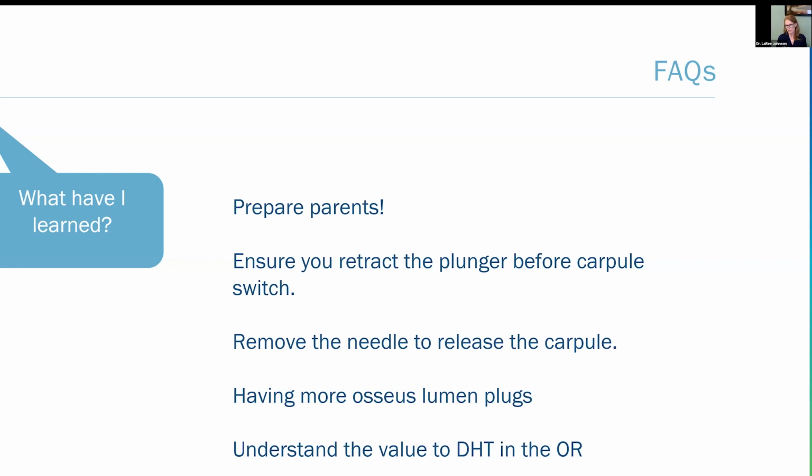maybe we should be using these in the OR. And some people do. I know Sarah Werb does. She's in the OR. It's great. And I have done it a couple days. And the funny thing is, normally when we deliver local anesthetic, and in our surgery center we only have lidocaine 1 to 100,000, you can hear the heart rate pick up when we deliver lidocaine. You don't hear it when you do intraosseous.